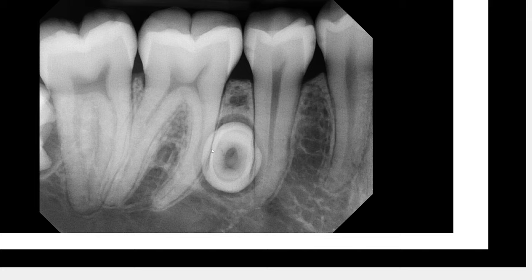Whether this is an odontoma or a supernumerary, one important question is whether there is root resorption of the associated teeth. The outline of the root appears normal without any overt sign of resorption; however, you have to think three-dimensionally even with a 2D image. Just because you see an intact root outline doesn't mean there's no resorption — part of the root of number 29 or the mesial root of number 30 may have been resorbed.